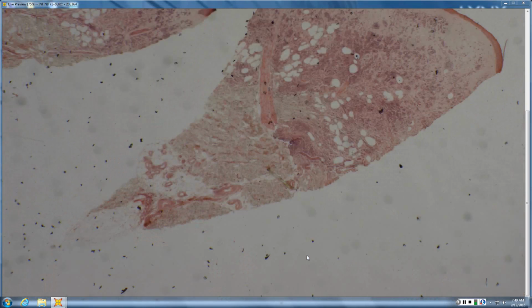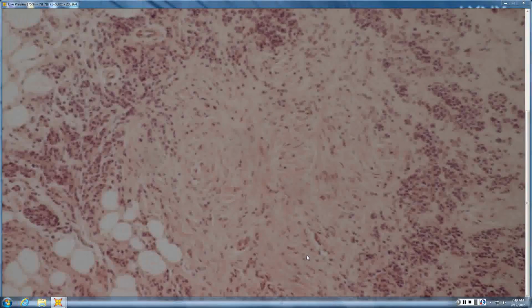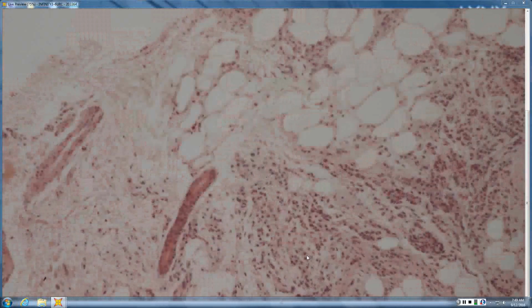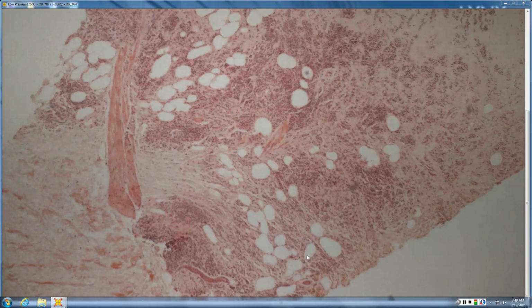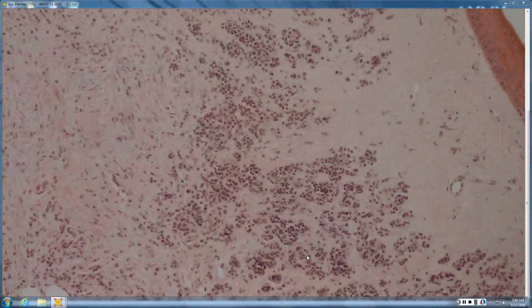So this has a population of cells in the more superficial reticular dermis. Okay. And then a little area of slight separation, and then nests of cells maturing down into single cells at the base. It has involvement of the arrector pili muscle or nerve. Exactly. When it's in a vessel wall, in erector pili, in nerve, it's a congenital nevus, right? So we've got a congenital nevus, and then the question is, did anything bad happen in this, or is this just a normal congenital nevus?